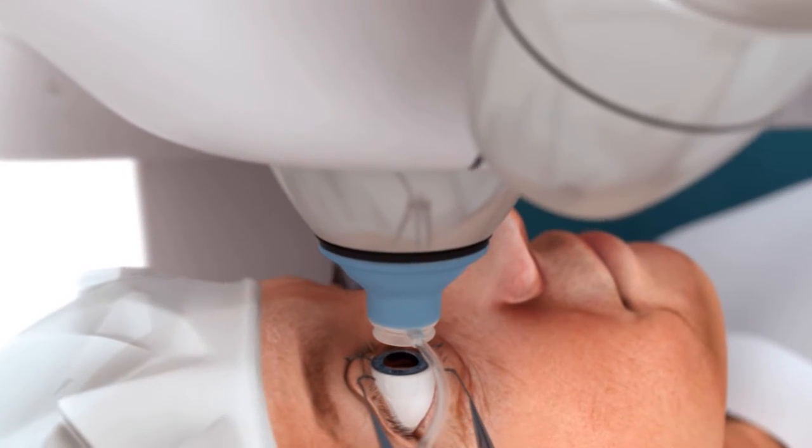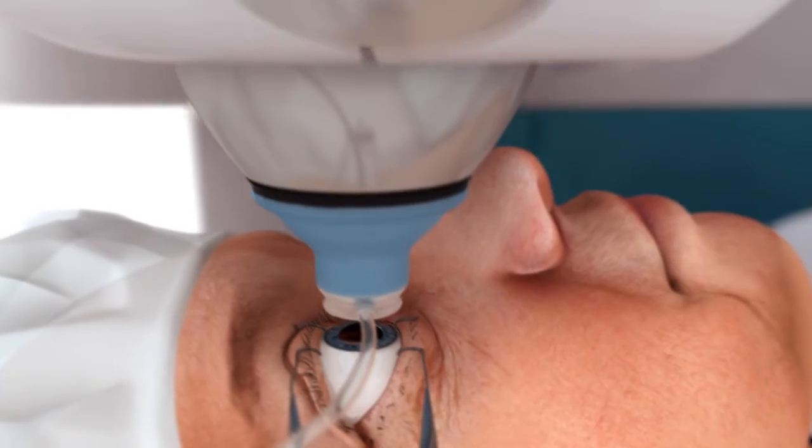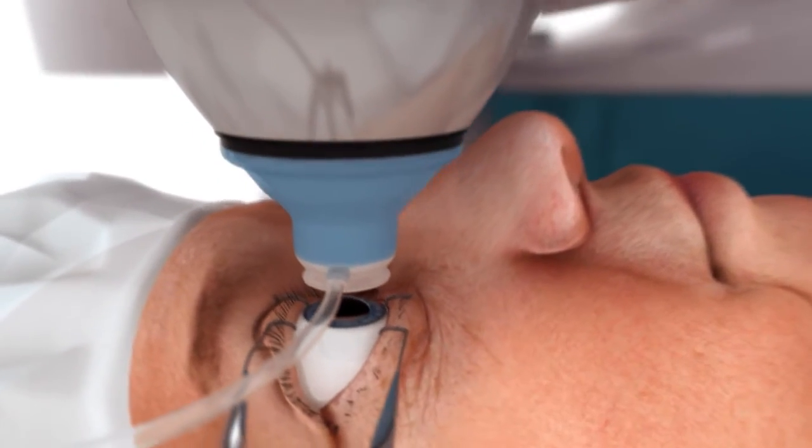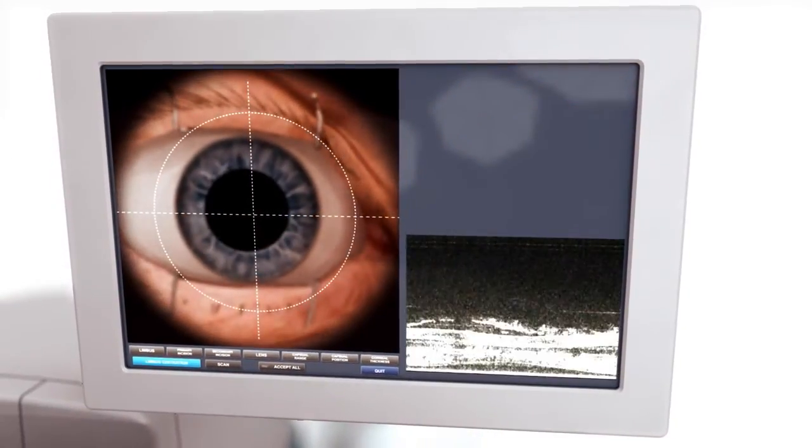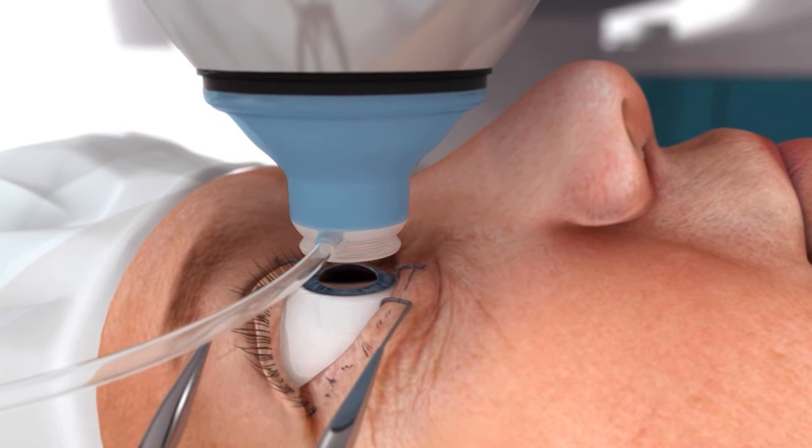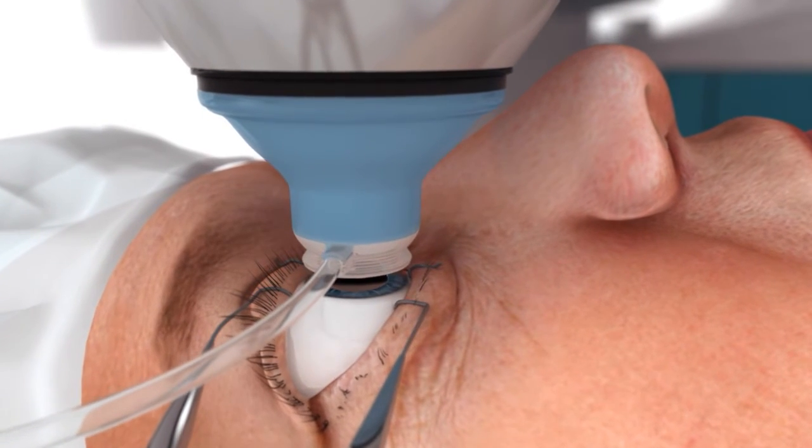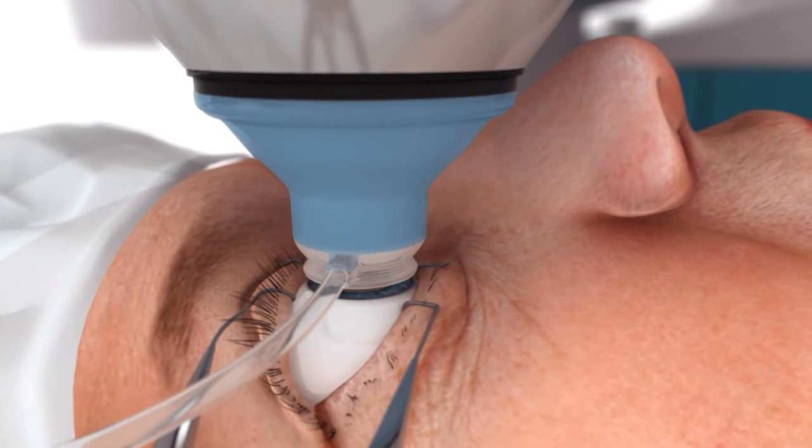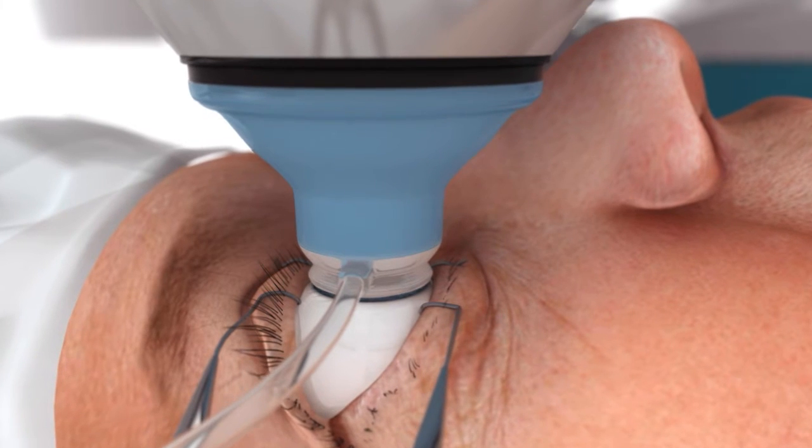The patient relaxes as the surgeon utilizes the high-resolution video microscope and live OCT image to gently guide and dock the disposable patient interface to the corneal surface.